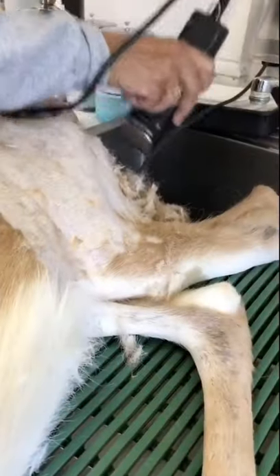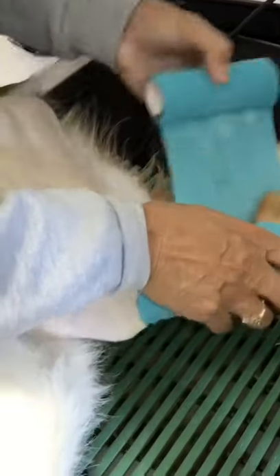We are using ISO to help her go to sleep. We are removing the fur from her leg and wrapping the leg in vet wrap.